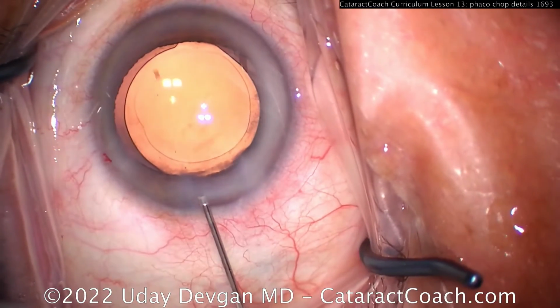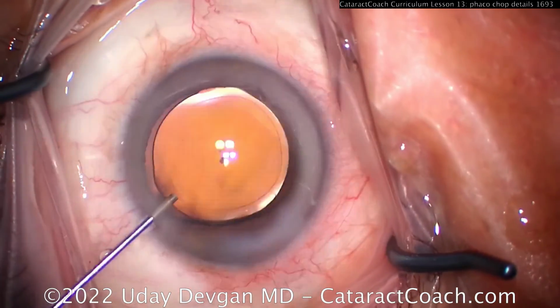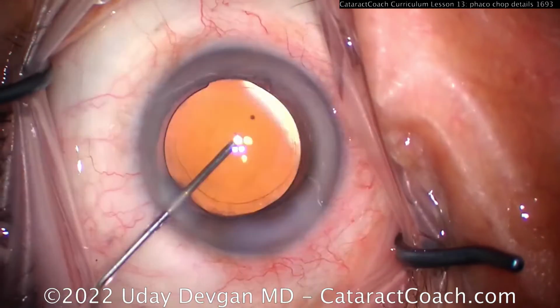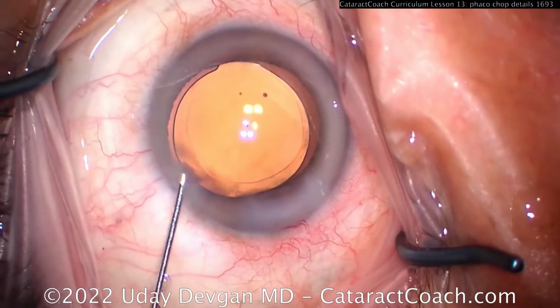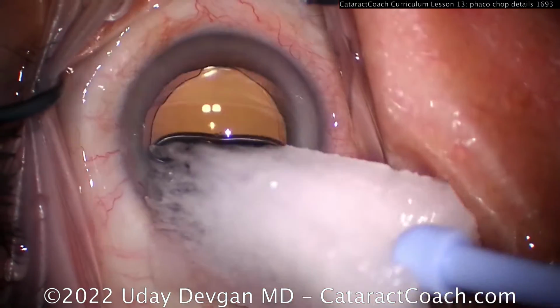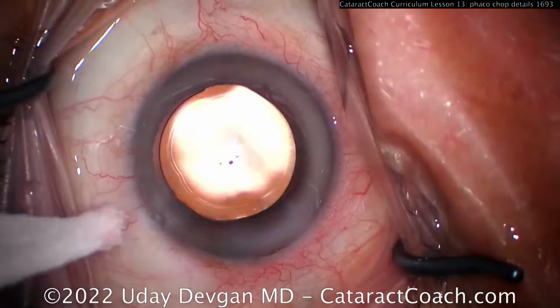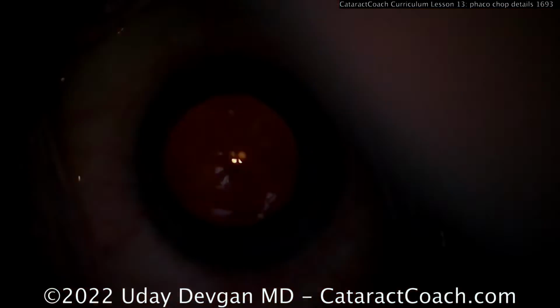And in case you're going to ask, let me tell you about the Phaco power. I just use a little bit of torsional energy, very low, and then I use an occlusion mode. So when the machine senses occlusion, it ramps up to a pulse mode where I can include some longitudinal ultrasound as well at a high pulse rate, and that's the case.